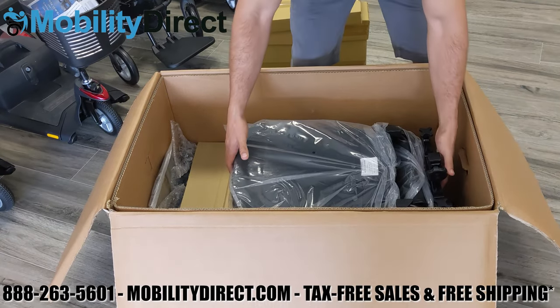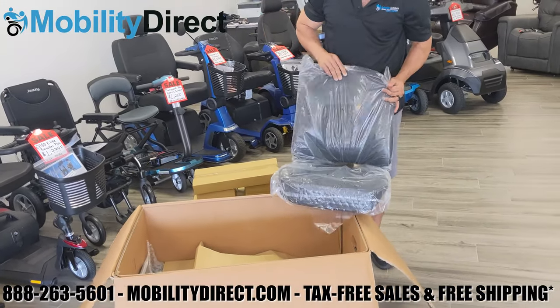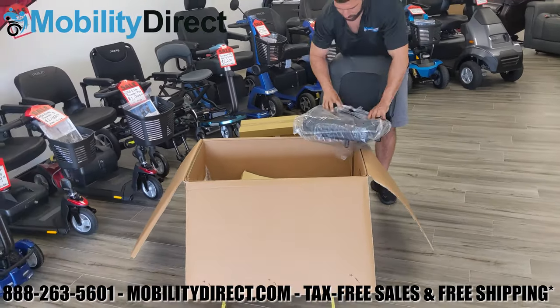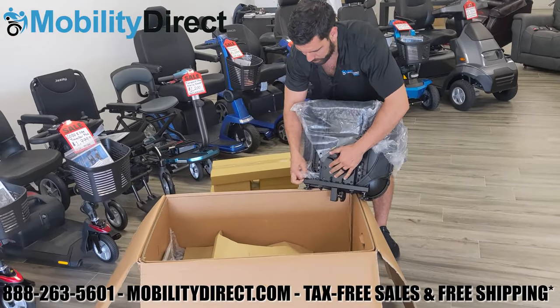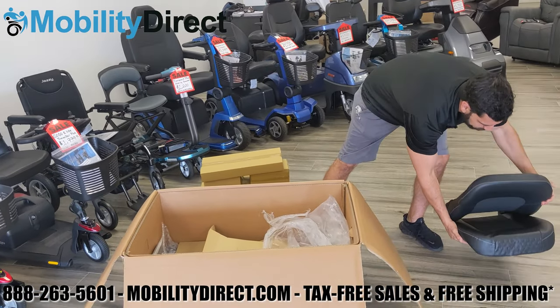Go ahead and grab the chair by the base and the top of the backrest, and make sure to remove all the protective plastic sheeting surrounding the backrest and the bottom part of the chair. Once you do that, put the chair to the side and make room so that we can get the base out of the box.